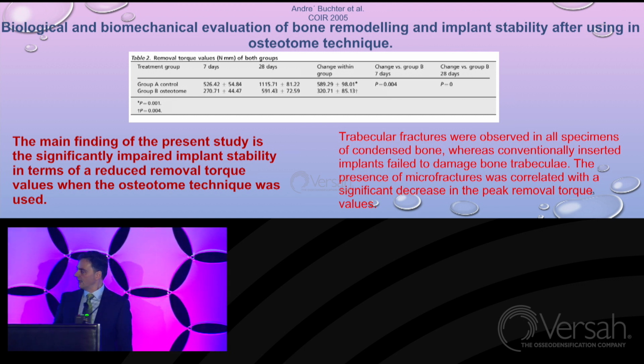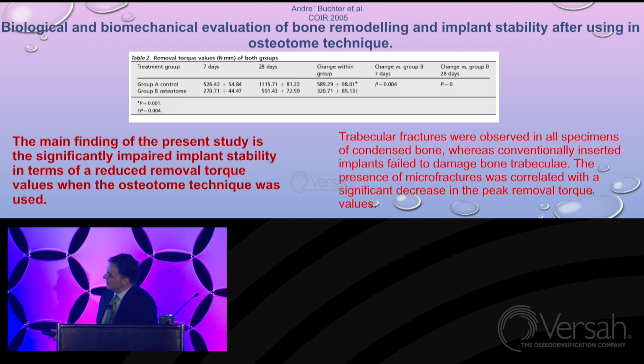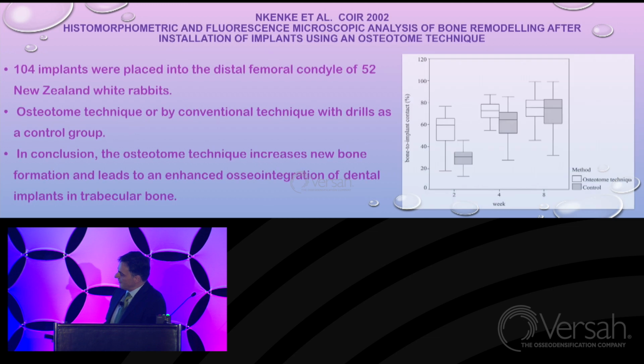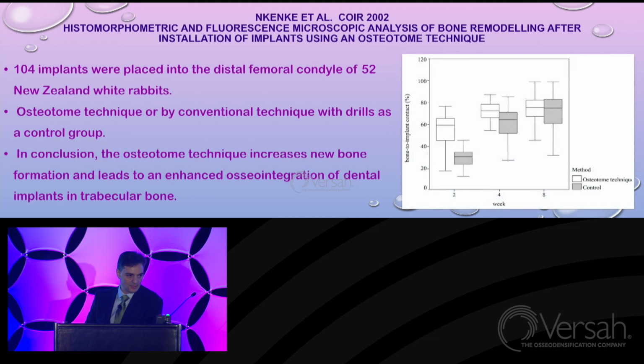This is only a study where they did histology without mechanics. And if you look just at the histology, you can find an improvement of the bone-to-implant contact, primary and secondary bone-to-implant contact. So histologically, it looks better. Mechanically, it is not so good.